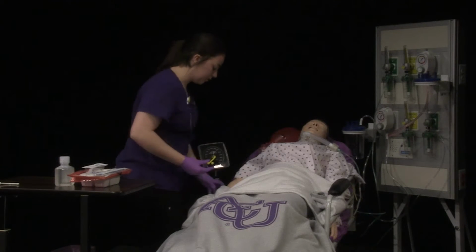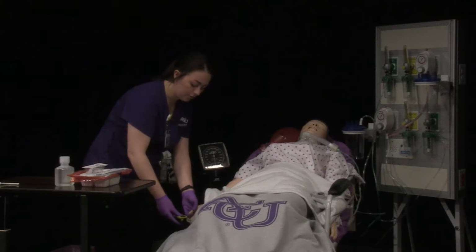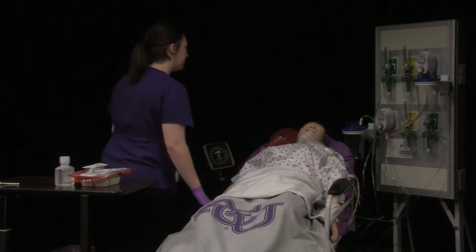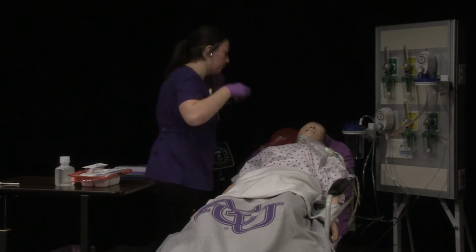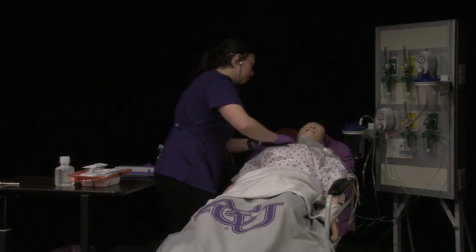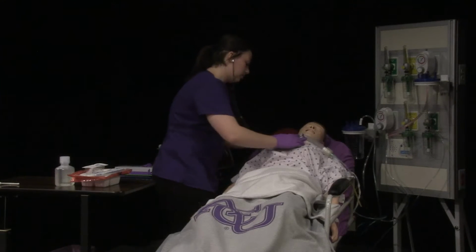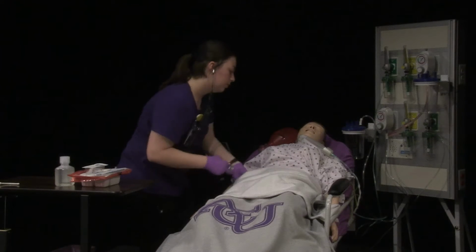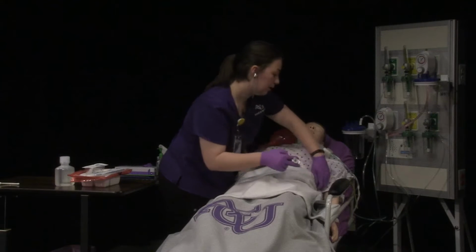I'm just going to check your pulse ox status. You can put this on your finger. All right. I just need to take a quick listen to your lungs. Just going to move your gown out of the way, okay? And take a deep breath for me. And again. And again. One more time. Okay, thank you.